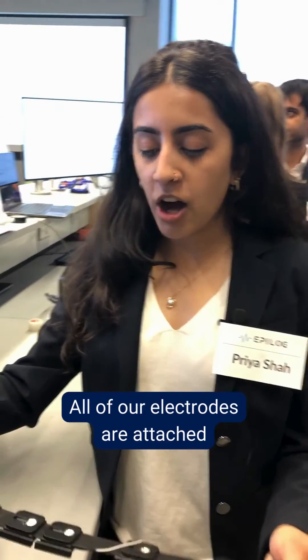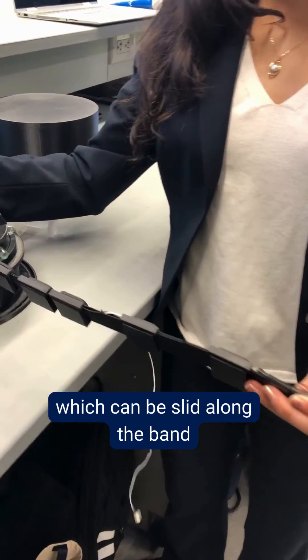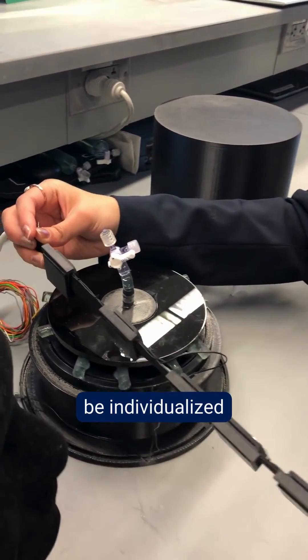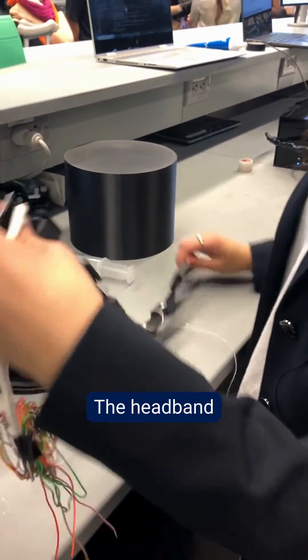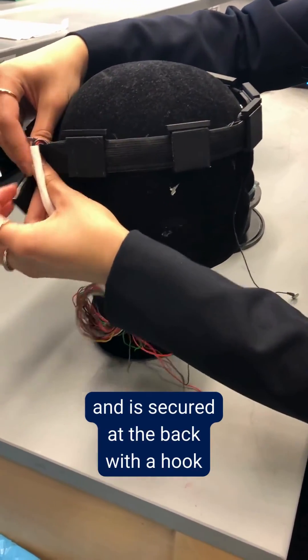So this is Epilogue. All of our electrodes are attached to these 3D printed brackets which can be slid along the band and positioned to be individualized for each patient. The headband can wrap around a child's head and is secured at the back with a hook.